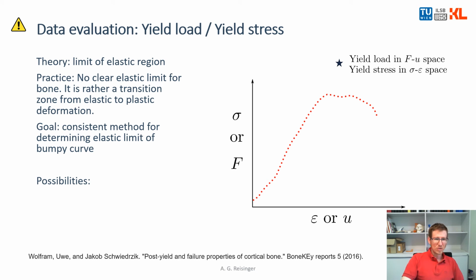Yield load or yield stress. That's the point where the first plastic deformation occurs. That's the point where, when you unload the sample again, some remaining deformation is still in place. That's the limit of the elastic region.